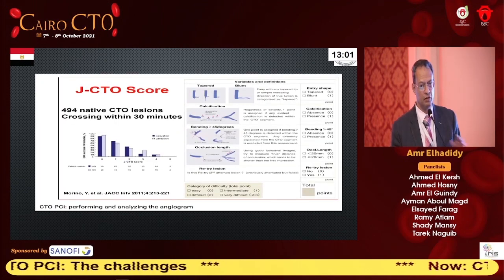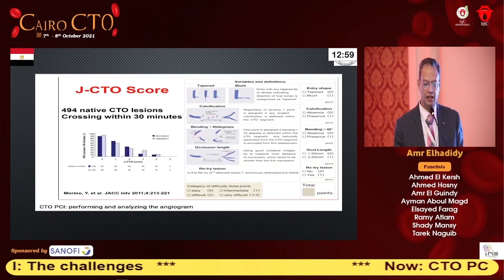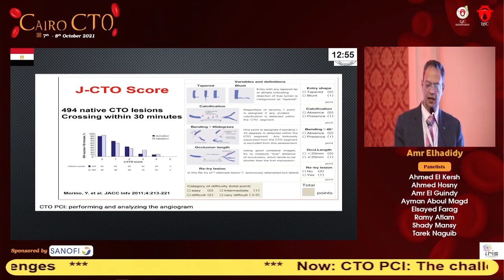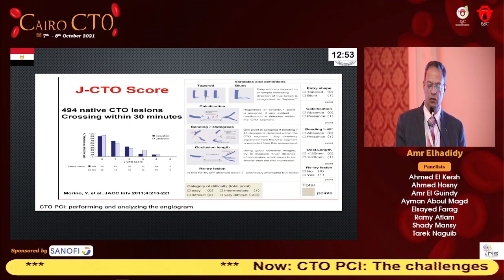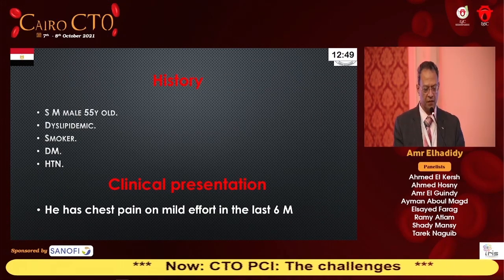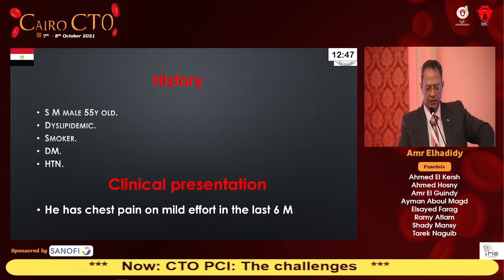So all we know, the Japanese CTO score, how difficult this case is according to different parameters. I will go just fast to see what to do in my case.